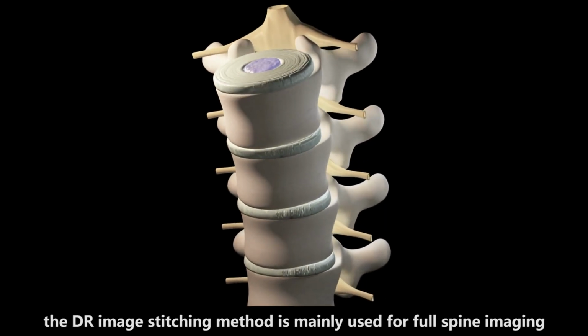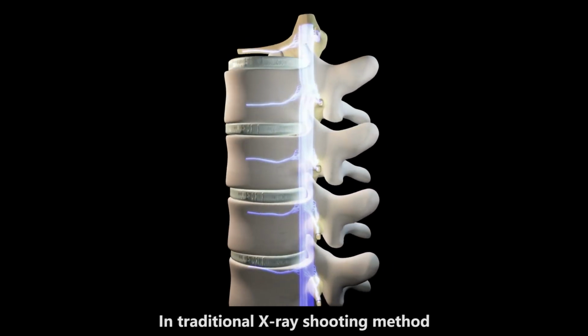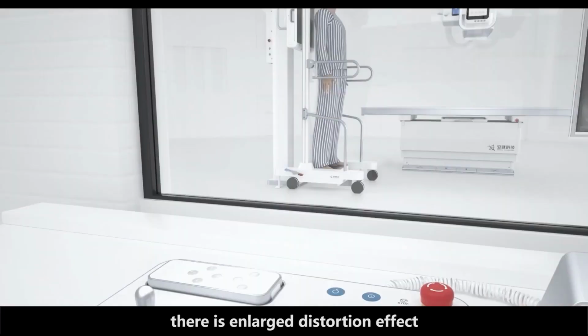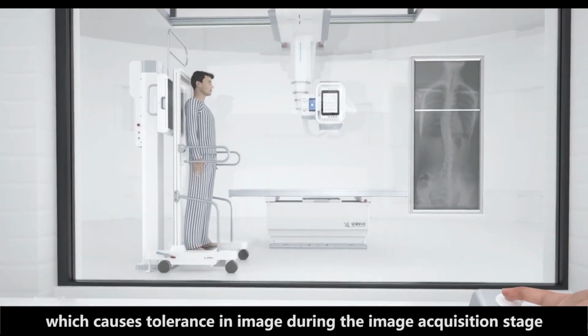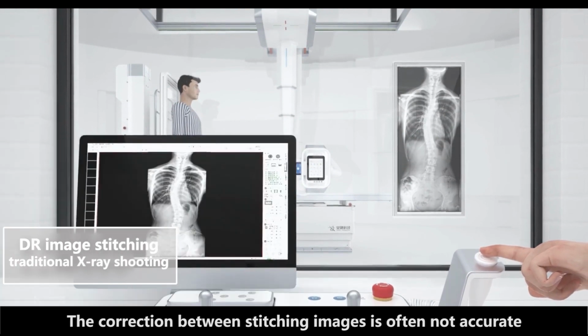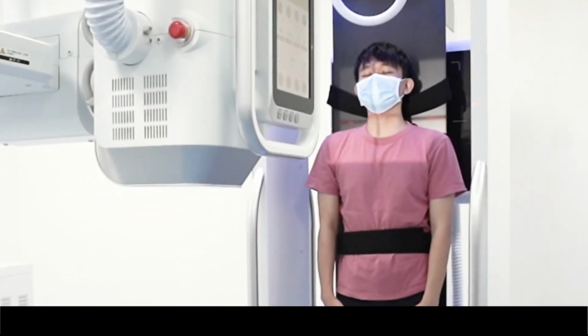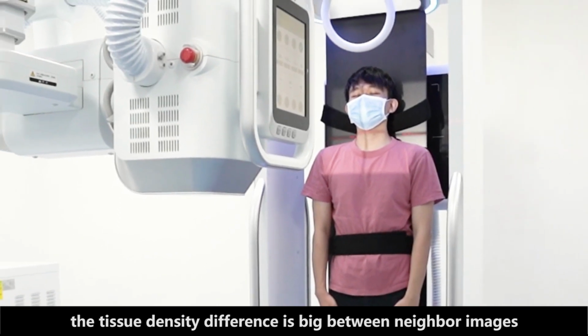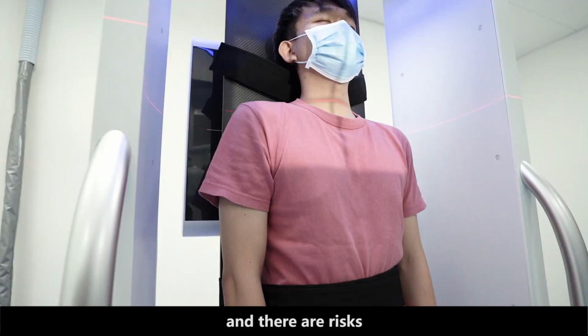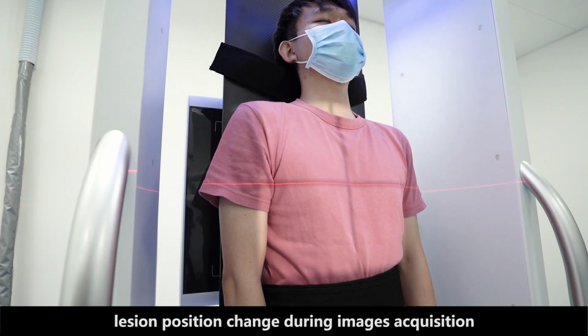At present, the digital radiography image stitching method is mainly used for full spine imaging. In the traditional X-ray shooting method, there is a margin distortion effect, which causes tolerance in the image during the image acquisition stage. The correction between stitched images is often not accurate. After multiple exposures, the tissue density difference between neighboring images is big, and there are risks, for example, lesion position change during image acquisition.